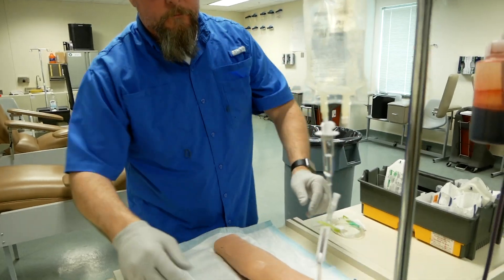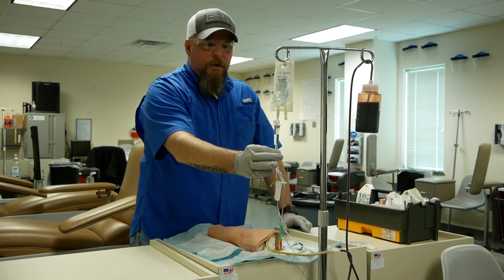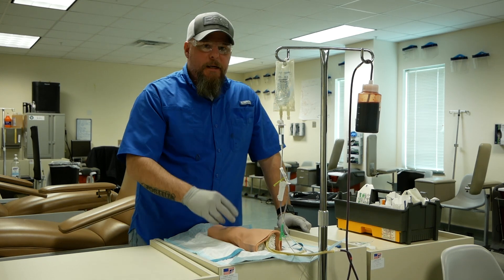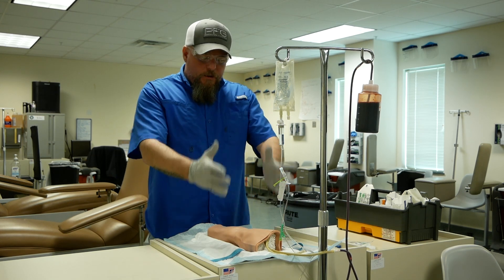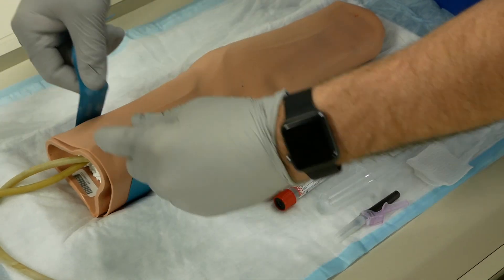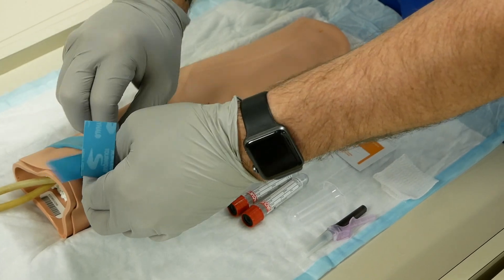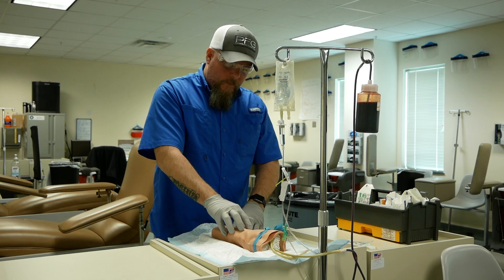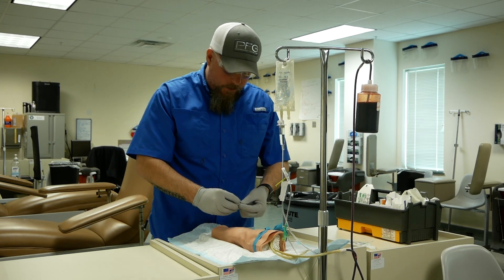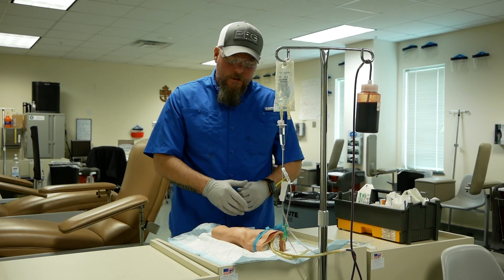Hang this up on the diving board and go ahead and label your tubing. Your instructor will say your medication bag is labeled, your IV tubing is primed and labeled, and this medication is ready to be administered — that will prompt you to do your third check. Your third check is triple DPRT and two patient identifiers. Next, inspect your arm for a good vein. Verbalize that you would place an absorbent pad underneath and apply your tourniquet two to four inches above the site. Anytime you put a tourniquet on, always tell them to make a fist. Find your vein and clean your site, ensuring that your vein is again not rigid, cord-like, or rolling and that it rebounds when you push on it. Start in the middle, work your way out, never crossing over the same area twice, and allow that to dry.